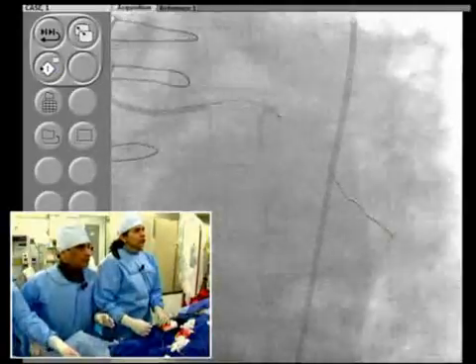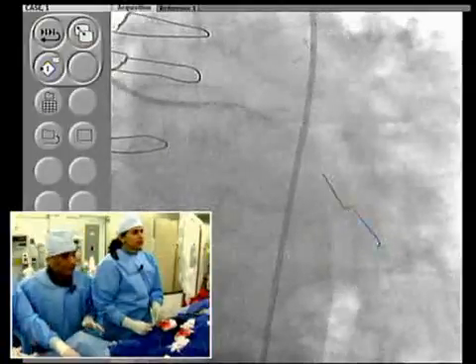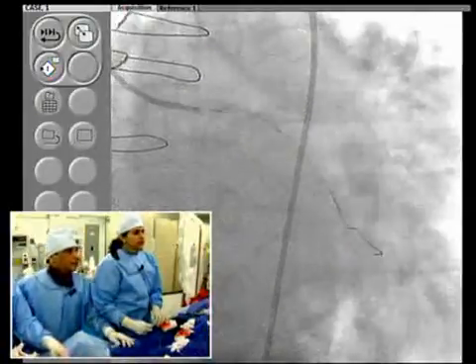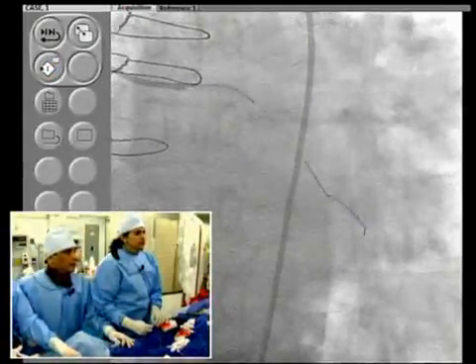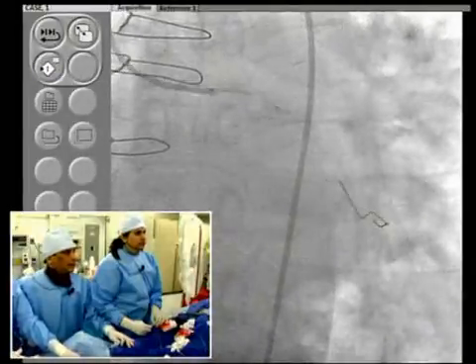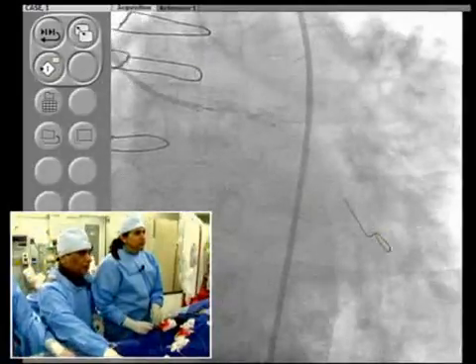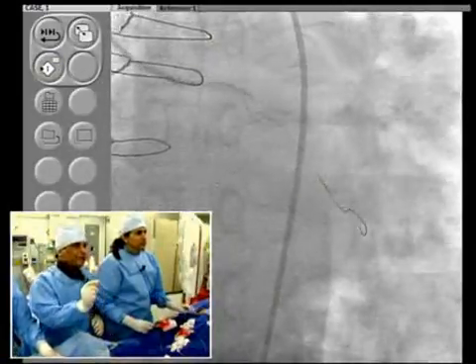The same. Yeah. So this is the Zion stent, your workhorse. That's it. Now pull back a little more. Tell me a little bit more about it. There is no balloon overhang beyond the markers? No, there is still actually the balloon there, but the stent is at the marker.